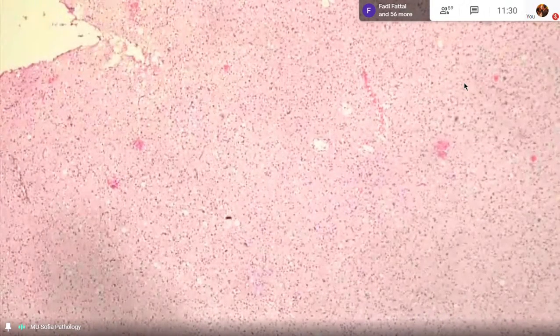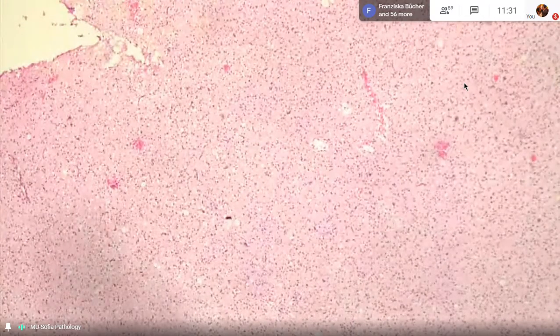This is the histology for the astrocytoma. I think it's an easy slide because it is just like a culture of normal astrocytes in the brain, so it's not a problem. Be careful with these small areas that look like empty spaces. These are microcysts. Do not think of fatty tissue, for example, because on the exam, when you are in stress, you think these are fatty cells.